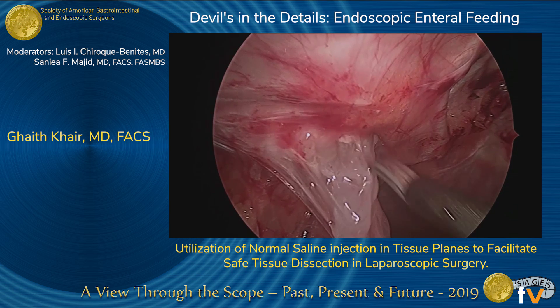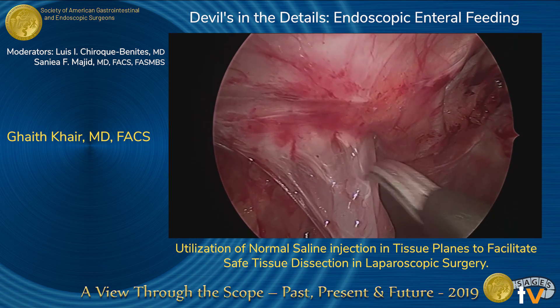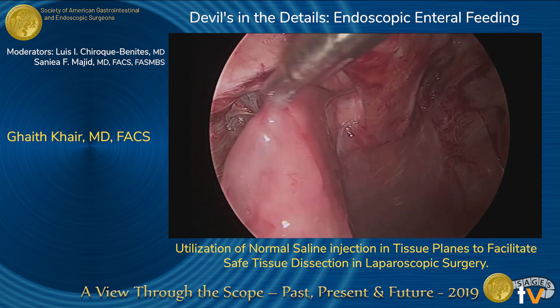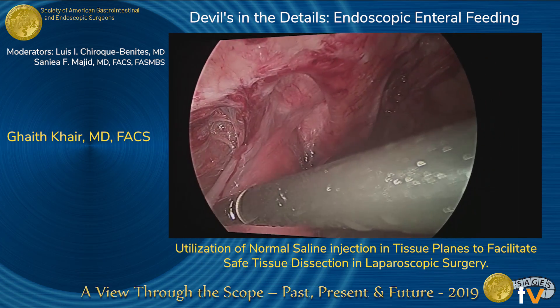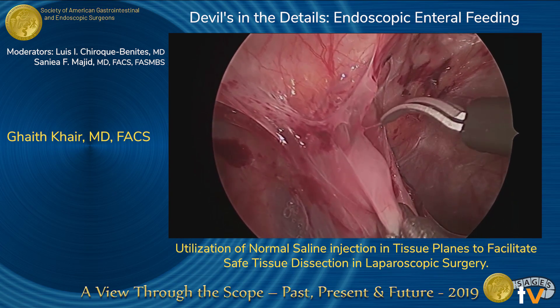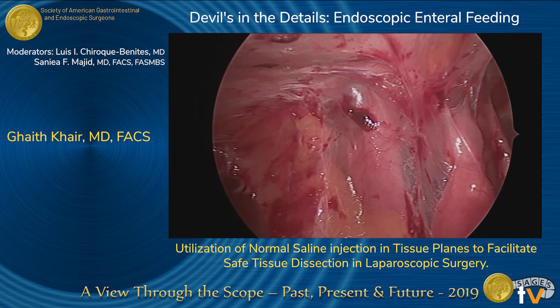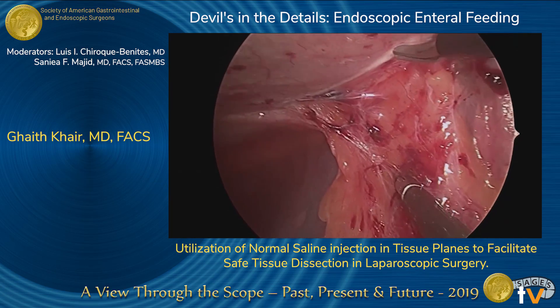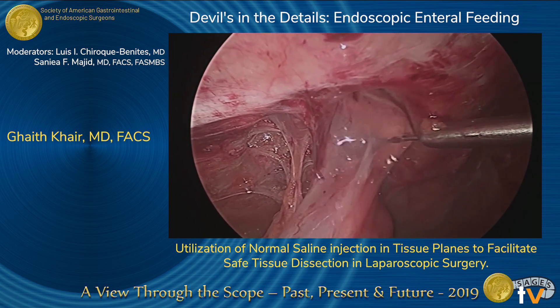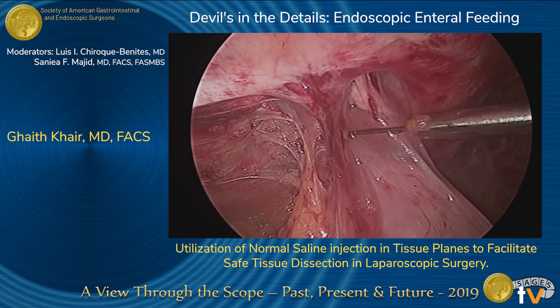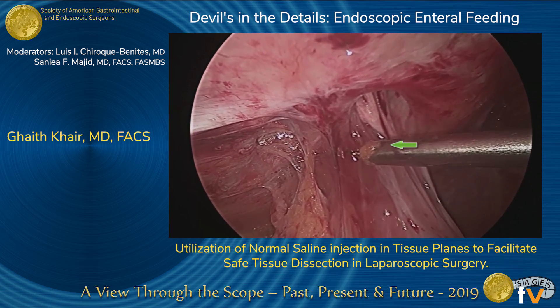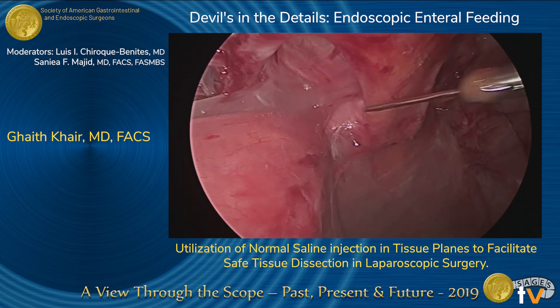Injecting the saline in the adhesions makes this distinction very easy. In this clip, there is a ventral hernia with the intestine prolapsing into the hernia, which makes the dissection difficult as the plane of dissection is not in the straight line. Injecting the saline between the adhesion allowed the intestine to drop down and hence be divided safely in the straight plane.